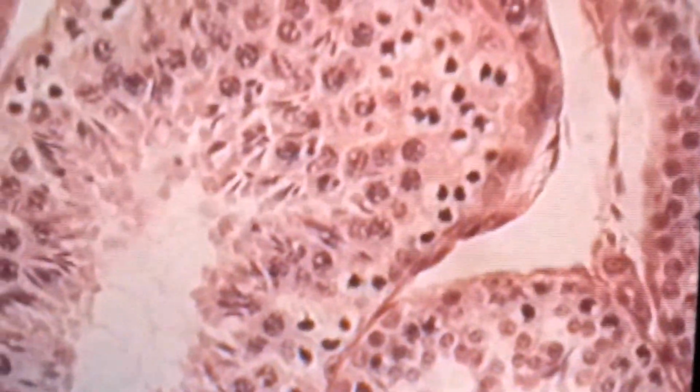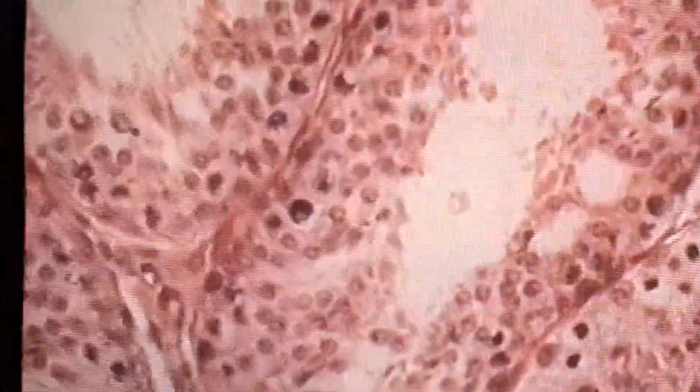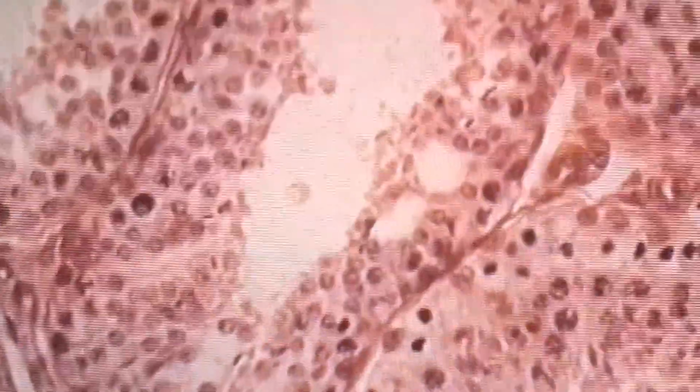What's that? Leydig cells. Those should be on the outside. You shouldn't miss that. These are all Leydig cells in between the seminiferous tubules, in the interstices. That would be interstitial cells. Those should be pretty clear.